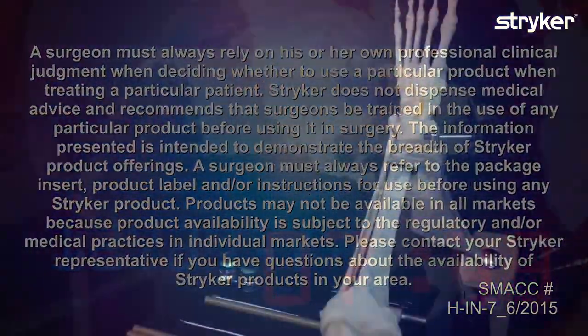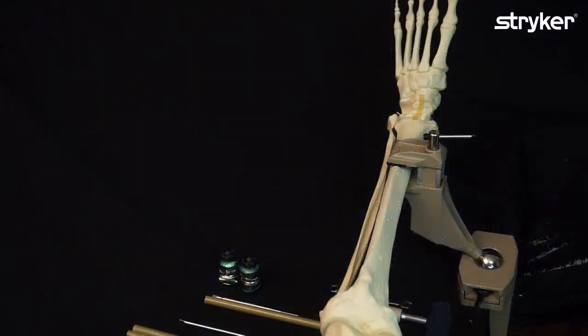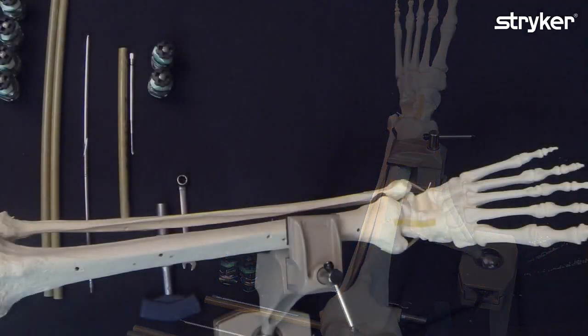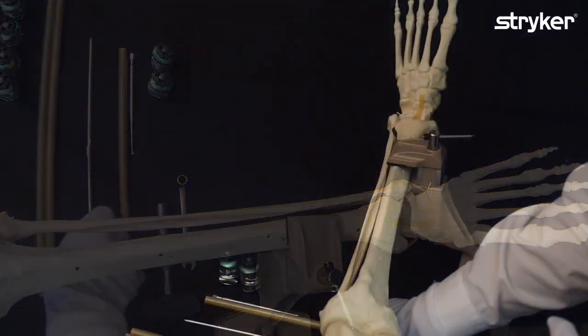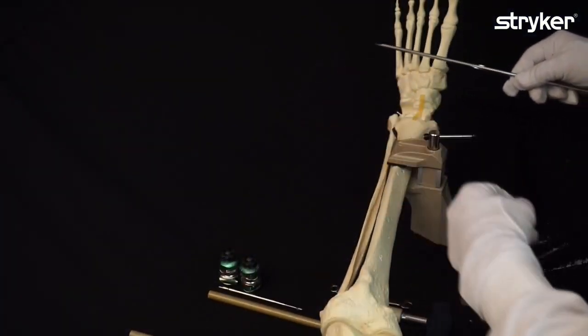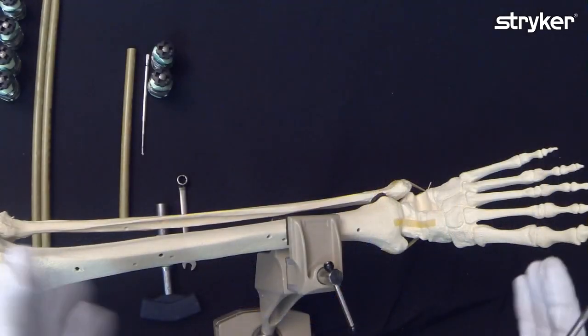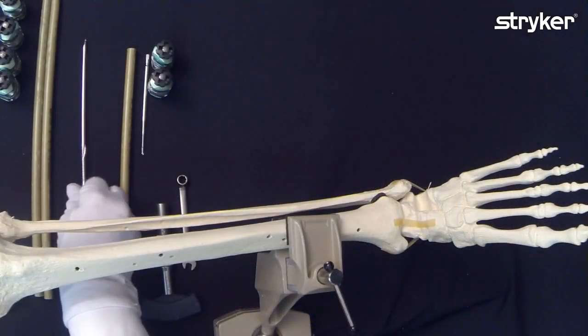Hello and welcome to another edition of our Hoffman 3 knowledge series. I'm going to show you a couple of different ankle frames today, and the first one would be one with a single pin in the calcaneus and a two pin construct in the tibia to distract that fractured ankle.